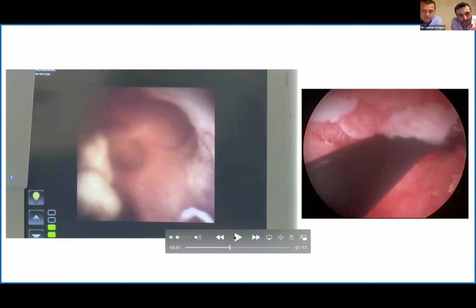We're going to slightly digress here, but one of the things that we've started doing a lot using our Trilogy is dealing with complex bladder stones in patients who've had reconstructions, in terms of Mitrofanov or bladder substitute, or they've got sphincters where access through the urethra or through the Mitrofanov is very difficult. So we've started to use that in terms of getting a direct puncture into the pouch or into the bladder substitute, and in order to get a fantastic clearance of the stone because of the excellent suction and the ballistic and ultrasound. Again, Laurian, you recently did an encrusted stent using Trilogy, didn't you?